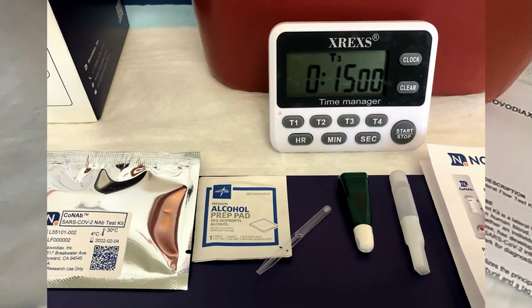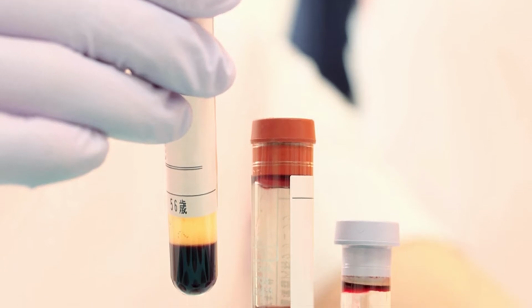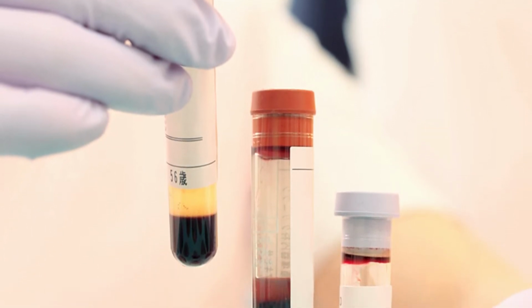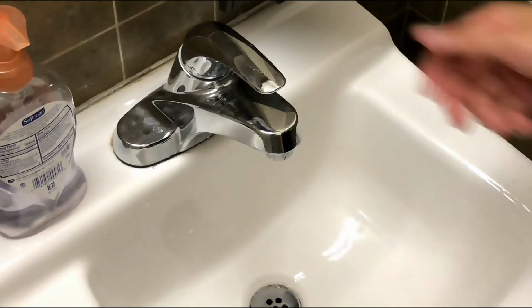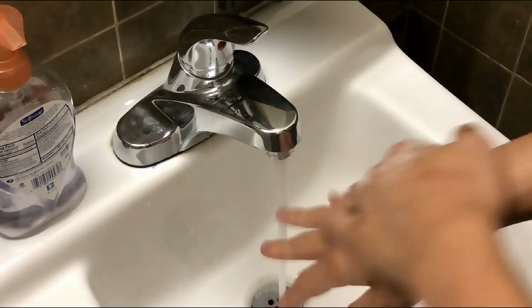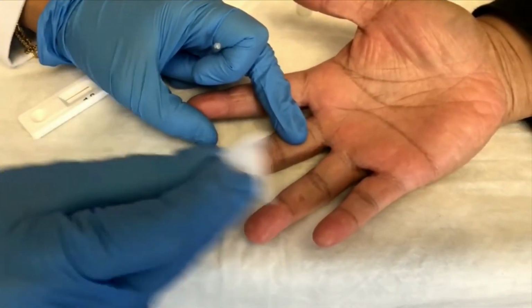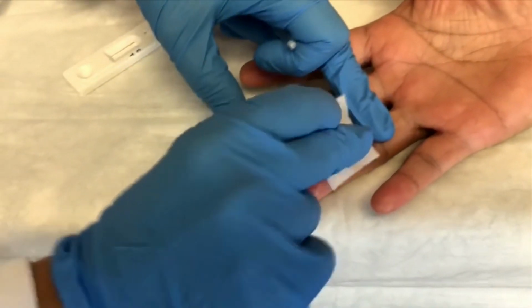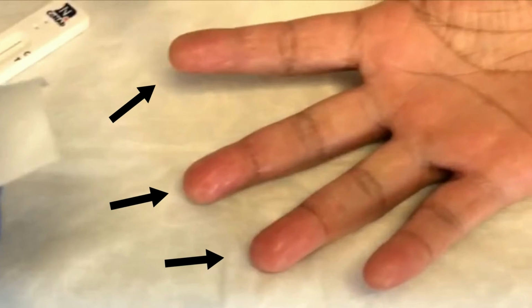Once the test area is set, prepare to collect the blood sample. The CoNAb test can use plasma, serum, or fingertip blood. In this video, we're using a fingertip sample. When using this method, have the individual first wash their hands in warm water to encourage blood flow. Using an alcohol swab towelette, clean the finger from which you wish to collect the blood. We recommend using the index finger or adjacent inside fingers to draw blood.